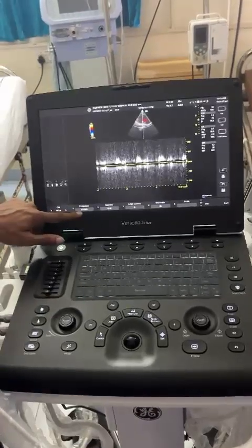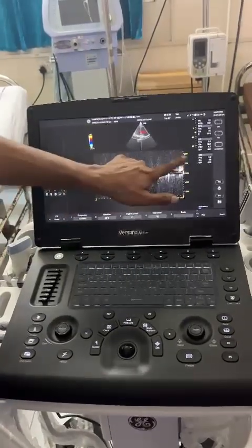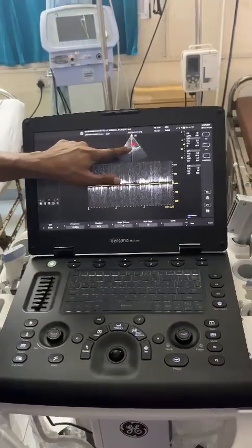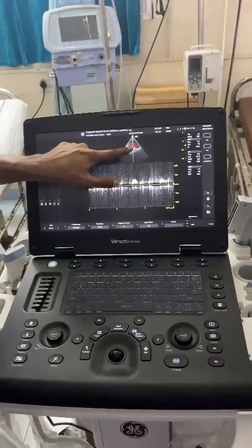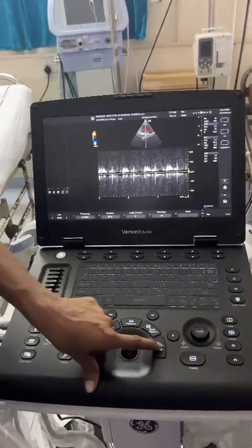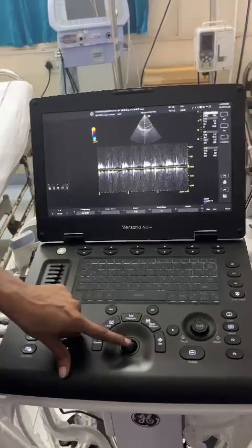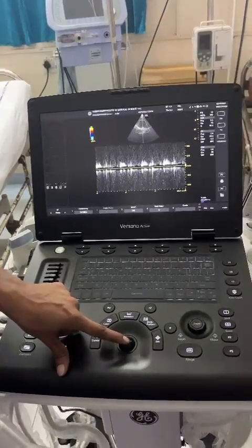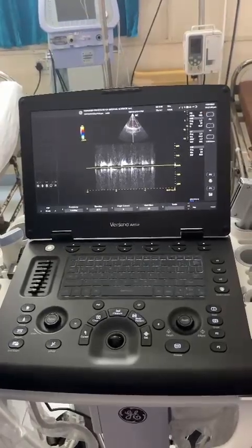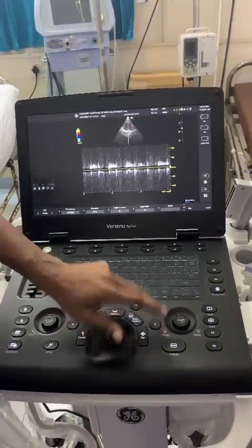Here also, you can adjust the frequency, baseline, and scale. If you want to change the position in B mode while doing the scan, press this one and it will update. In B mode, you can just change the button and press again and it will go. We need to go back to B mode again.